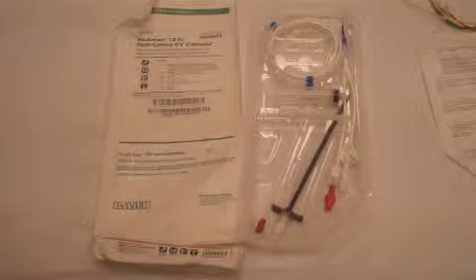You will notice that these types of catheters have what is called a Dacron cuff, used for stabilizing the cath and decreasing infection incidence. Eventually, the tissue will grow around the cuff to secure it in place. Periodic heparin flushing is needed to maintain patency. However, you must look at the brand for they may have different requirements.